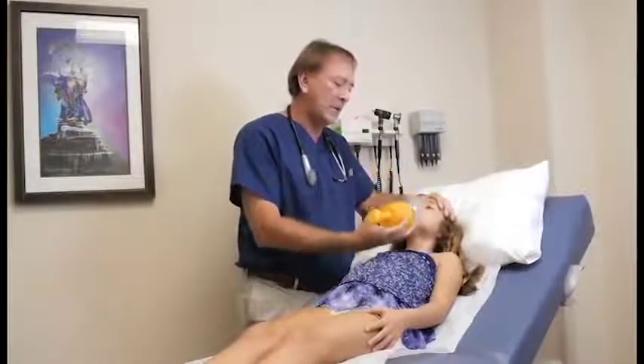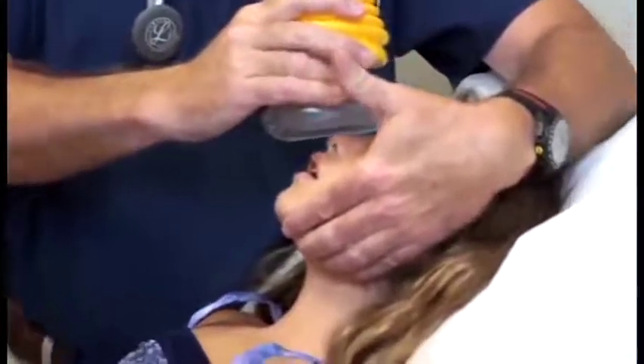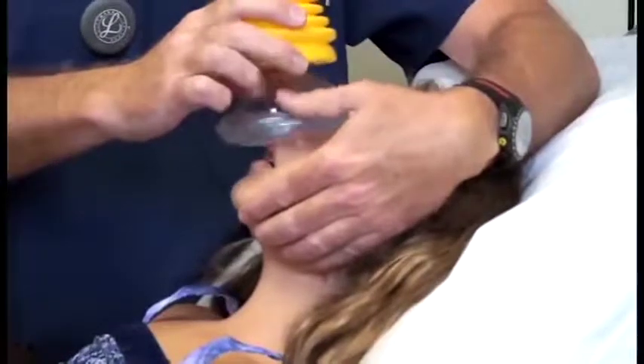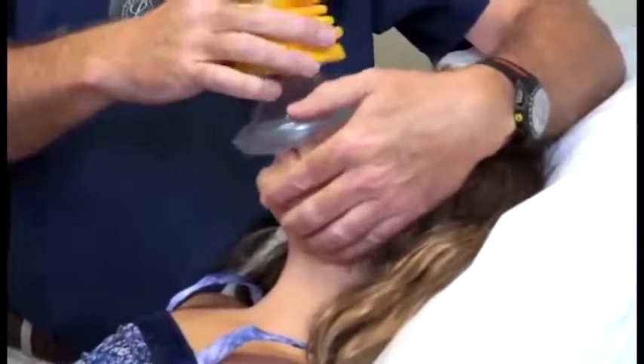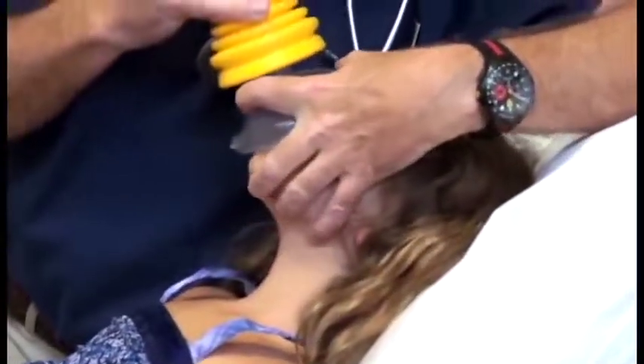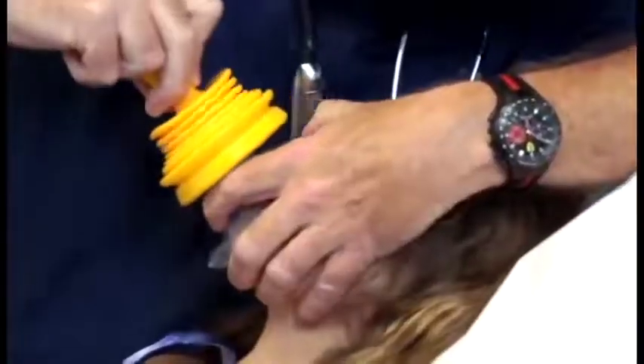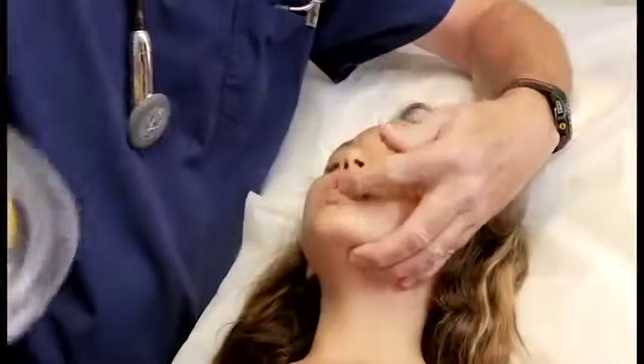You don't just slap it on sideways or anywhere. The apex of the mask is placed on the forehead, going down to the area called the glabella, between the eyebrows. Pushing down on the face, holding the top and bottom of the mask with your two fingers and the jaw with your other fingers, creating a tight seal. Push down hard. Pull up hard.